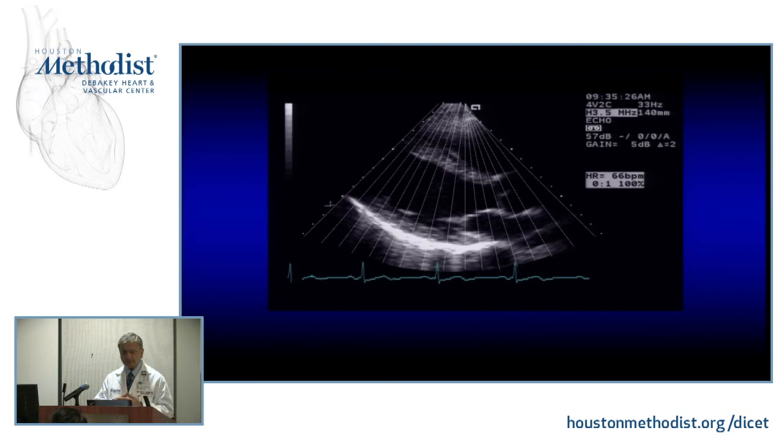of view. Why is cardiac ultrasound in a V shape, a 90 sector or 30 sector? Because you have to deal with ribs, okay? If you're doing abdominal ultrasound, actually you have a box. If you're doing a vascular ultrasound, most likely it's a linear array, so you don't have to scan it, it's basically a linear array. But for us, I think you have to do that.